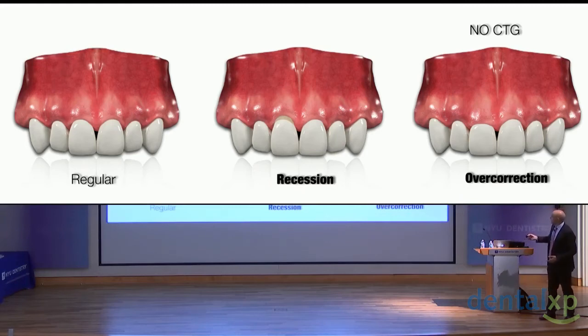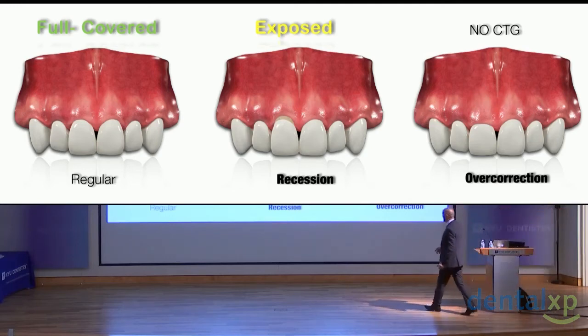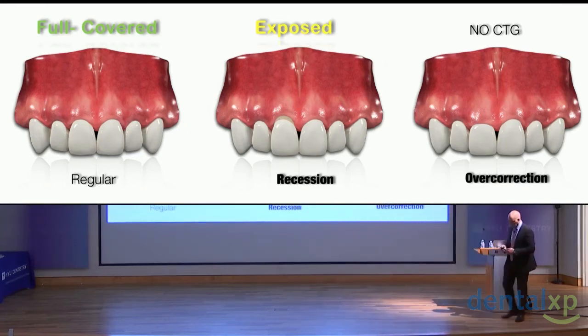But in this case, I prefer to expose the connective tissue graft in order to cover the recession, or to cover the connective tissue graft fully in that other case. Of course, it depends on the clinical situation, because sometimes I can coronally advance this tissue without any vertical releasing incision. Of course, there are many ways to go wrong.